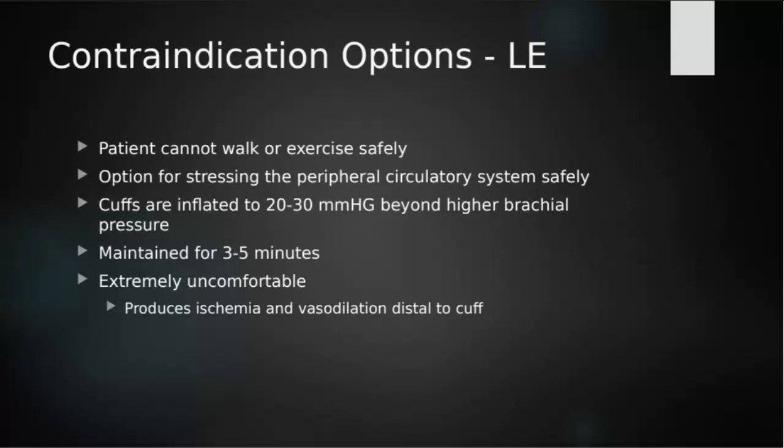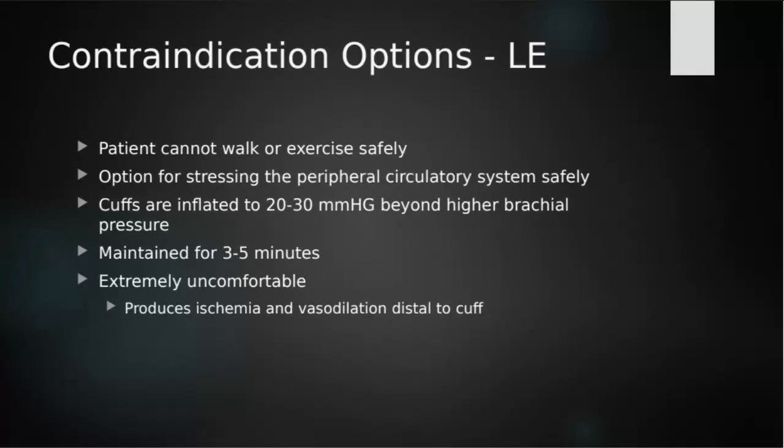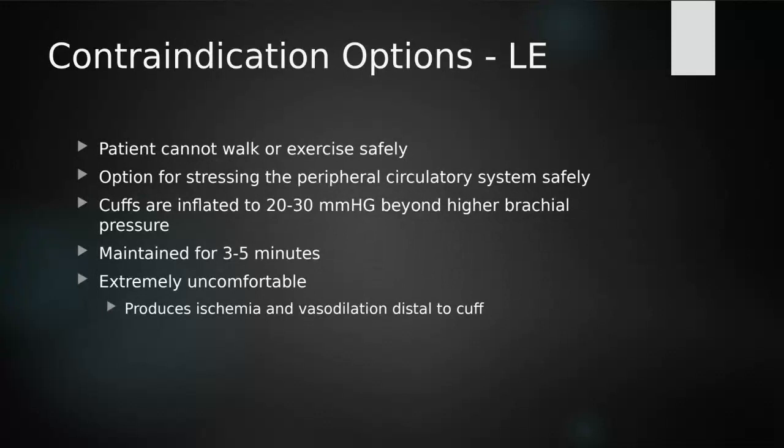It's going to produce intermittent ischemia and vasodilation in that foot, so distal to that ankle cuff. It is extremely uncomfortable. Their toes are going to turn blue. They're going to turn white. They're going to be in a lot of pain. So this is something that, you know, we're not really doing too often.